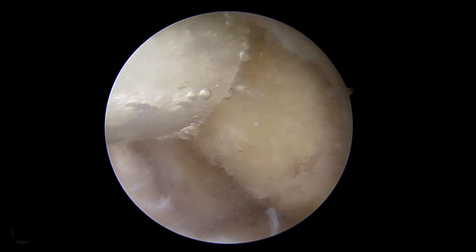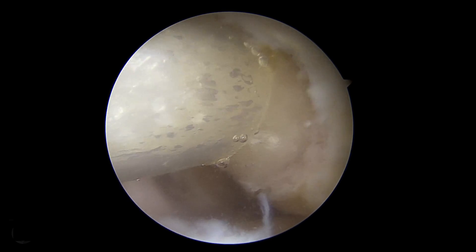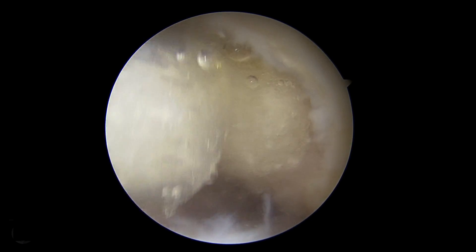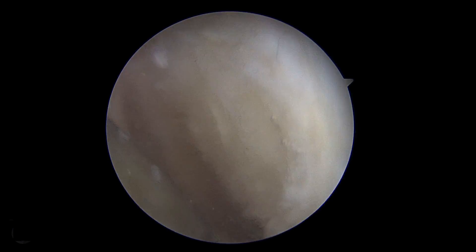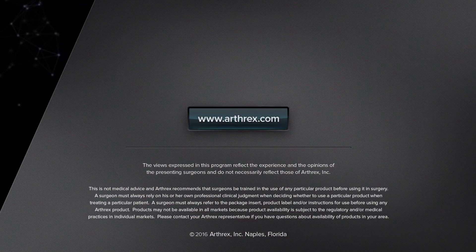The reverse phase medium prevents it from being washed away with the saline used in arthroscopy. In this case, we've completely filled the femoral defect — looking at it from the medial portal, that's awesome. Thank you for joining us.